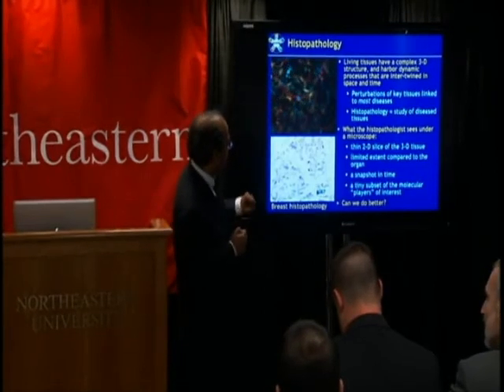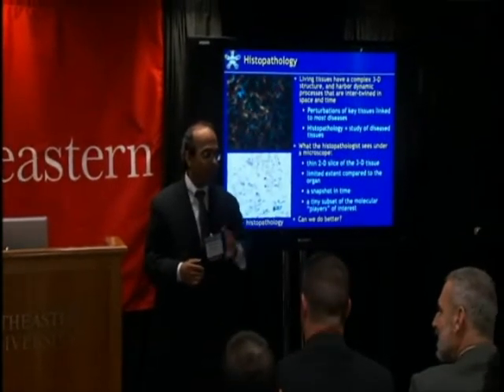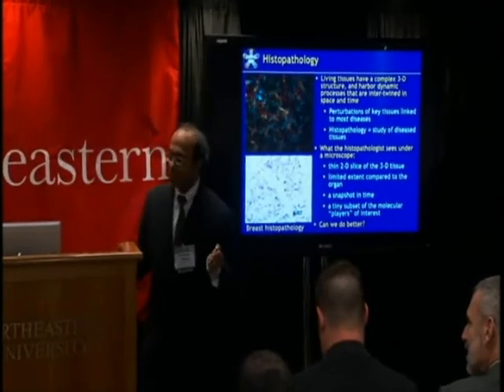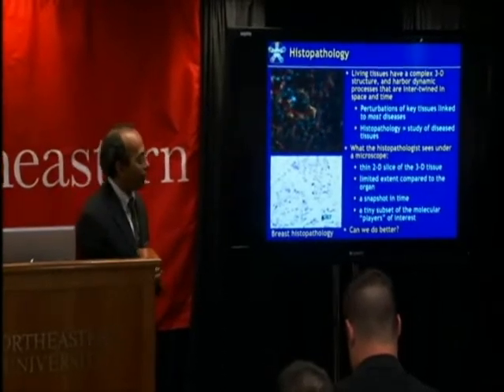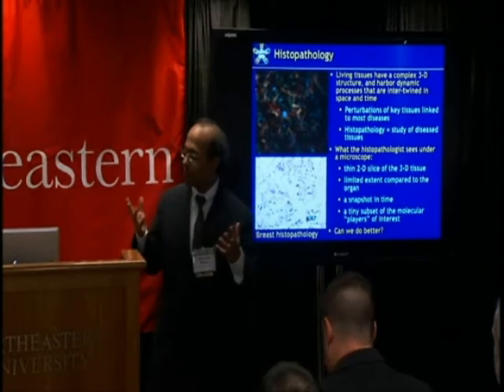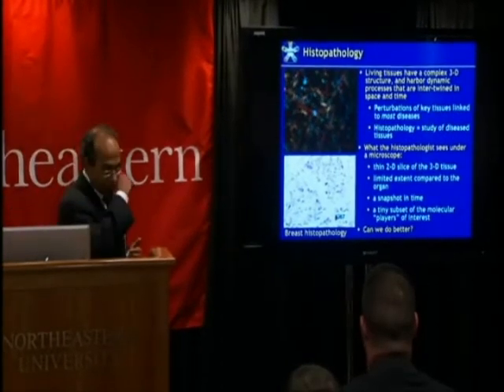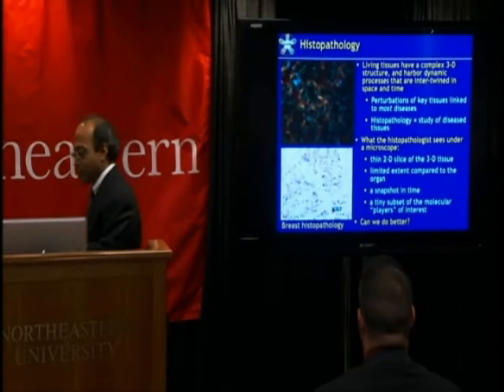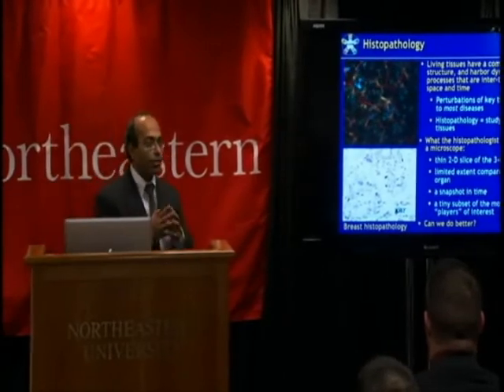So, when Milind was talking about his Vivoscope, you're talking about finding nuclear detail, right? So that you can actually diagnose what's going on. So I wanted to essentially pick up from there. So in the current day and age when, unfortunately even now, when a patient is detected to have some disease, once you pass the detection stage, you need to get to the diagnosis stage. So if you think about a disease like cancer, or even just a particular form of cancer like breast cancer, it's not one disease, but one of n flavors of breast cancer. You need to subtype them.